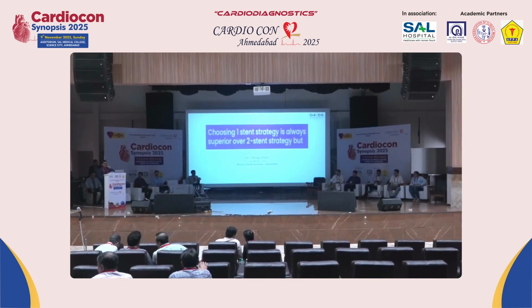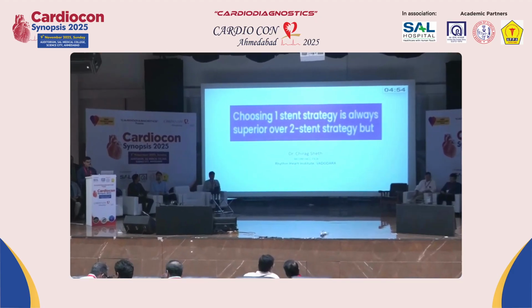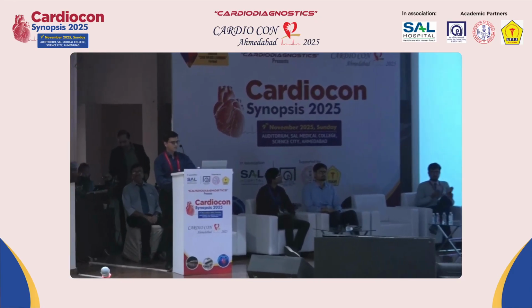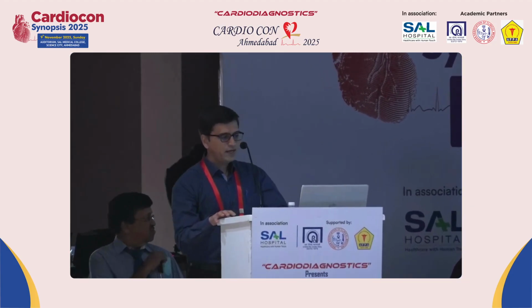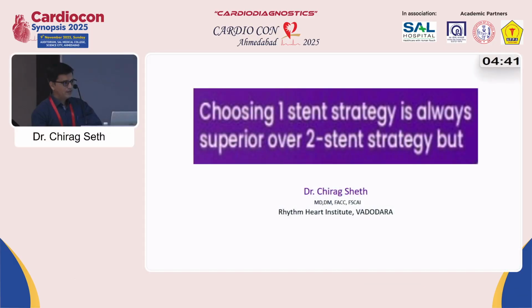Friends and colleagues, going over to the topic on interventional cardiology, the case details have already been given. Elderly diabetic male with non-STEMI, low ejection fraction, raised troponins, and a true complex bifurcation, that is Medina 111. And conventionally, yes, all bifurcations one would start with a provisional strategy. But the question is, choosing one stent strategy is always superior over two stent.